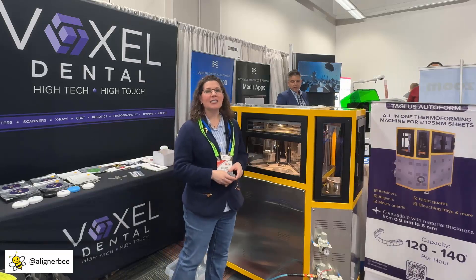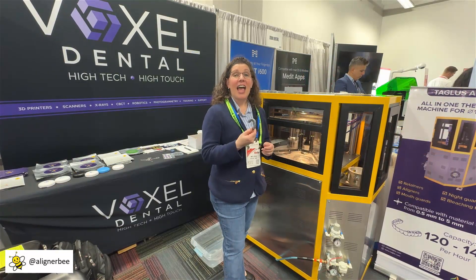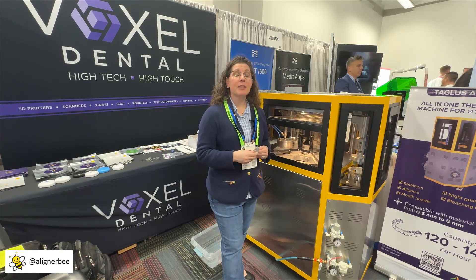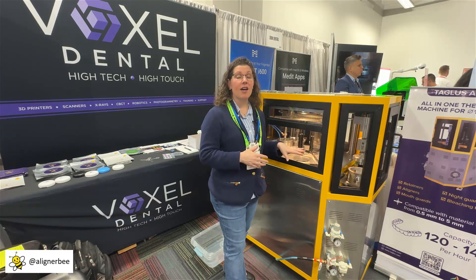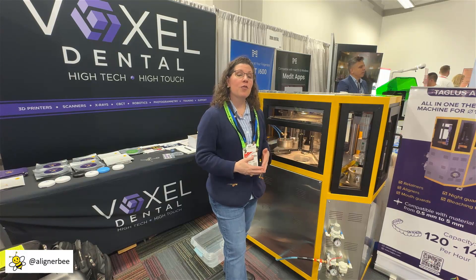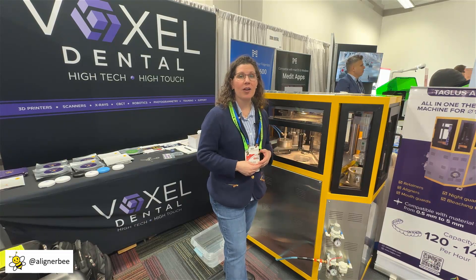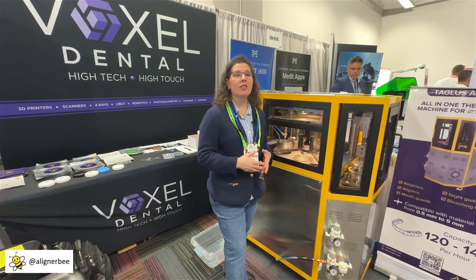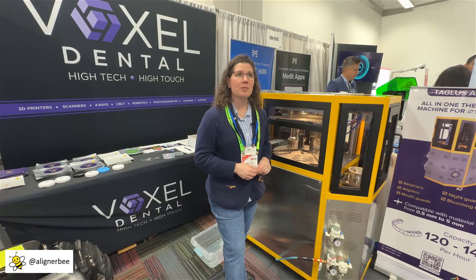So let's go ahead and take a little closer look at how this process can be automated. Once our production laboratory has finished our 3D printed models, it simply takes one person to stand and feed the models into the automated machine. With the automated vacuum forming system, you can vacuum form between 120 and 140 vacuum forms per hour. This can facilitate freeing up a lot of technician time that can be utilized more for trimming and polishing of aligners.